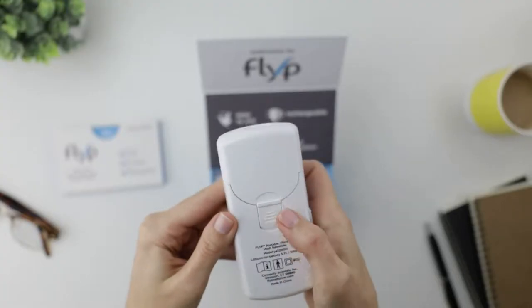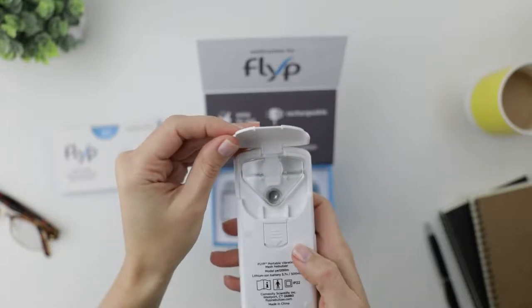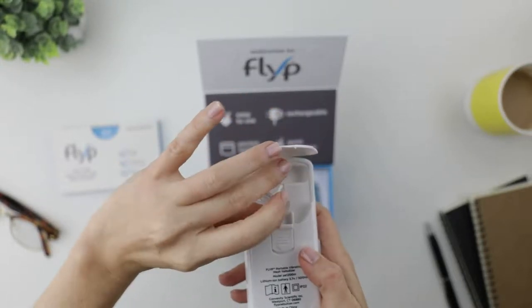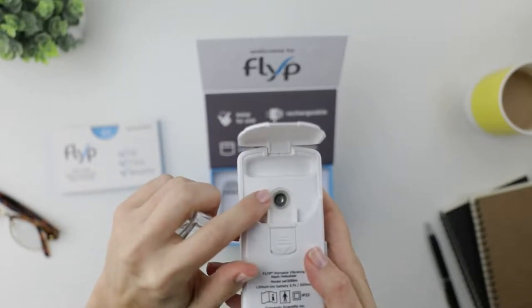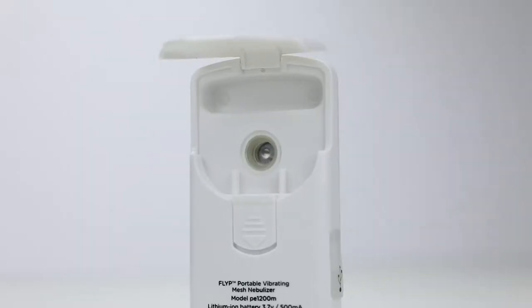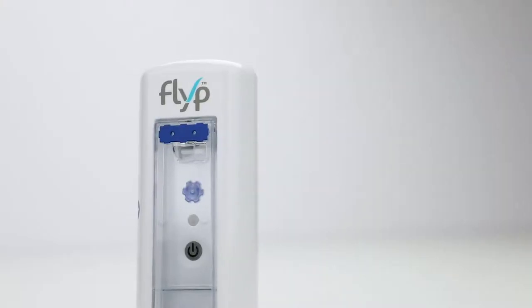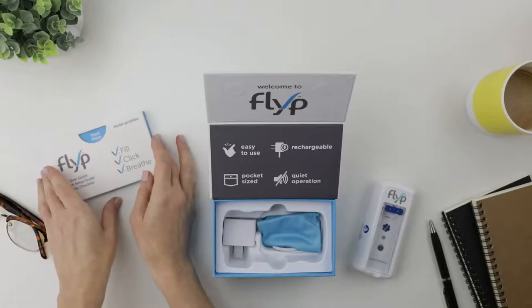And here's where you turn it on and off. The back snaps open and we have the medication reservoir — it pops out, another easy-to-clean feature. And there's the other side of the disc. Kind of hard to imagine, but it has over 1,000 microscopic holes. I hear treatments take only about seven minutes — I'm down with that.